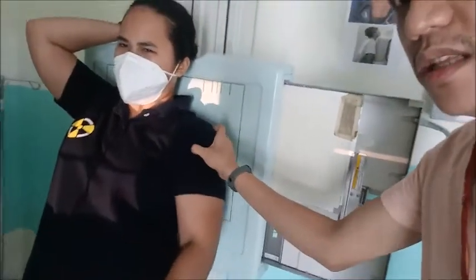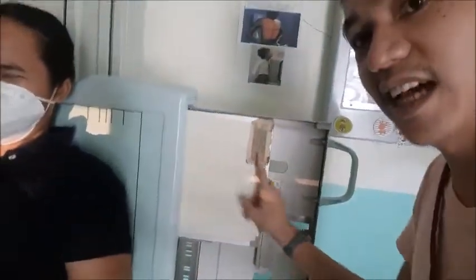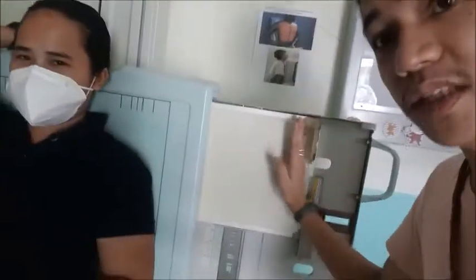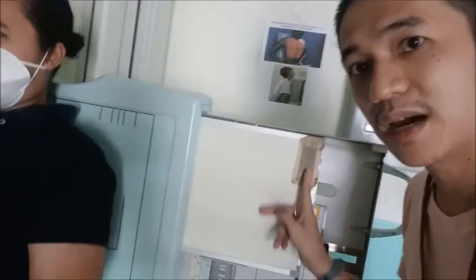So that means the structures, instead of being projected perpendicular, they are projected towards a superior magod nga portion. So that's why isaka na to balik ato ang cassette. So right side of the patient, right side of the cassette. So same lang gihapon, diba? We always follow the rules. Right side gihapon ni ang ato ang ID mark.